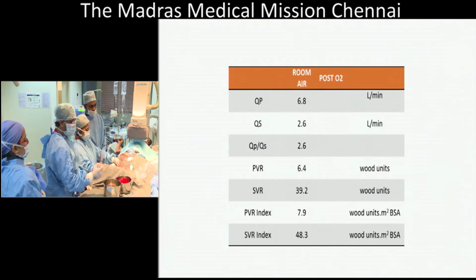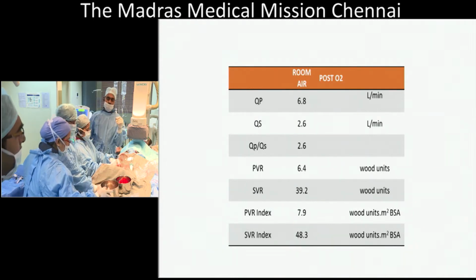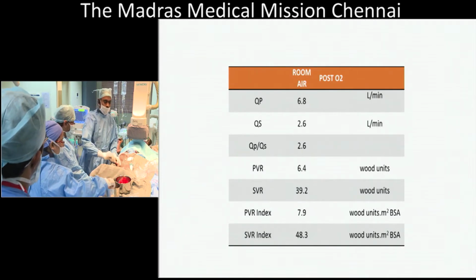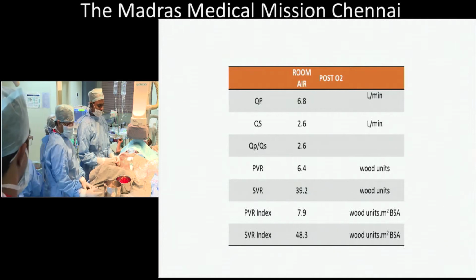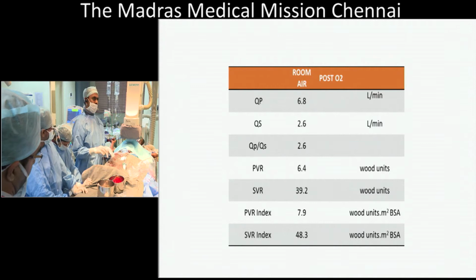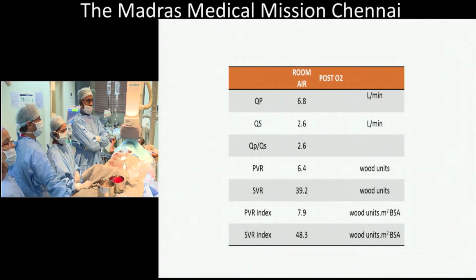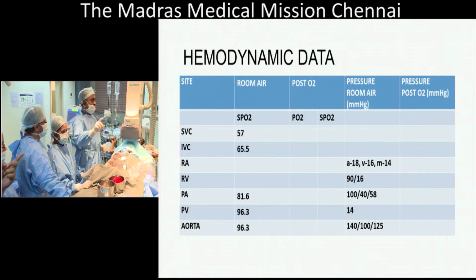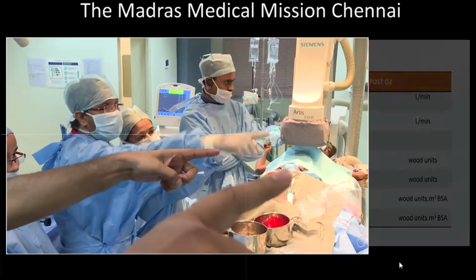Not 6 months, Shiva. They may require pulmonary vasodilators lifelong. And believe me, even with your fenestration, don't think that they are not going to require pulmonary vasodilators. So if there is a role for pulmonary vasodilators, do you think there is a role in partially fenestrating them rather than completely closing? Show hemodynamics live. I'm not saying don't do it, but in my practice, given this hemodynamic data and this clinical picture, I would not hesitate to close the defect completely.